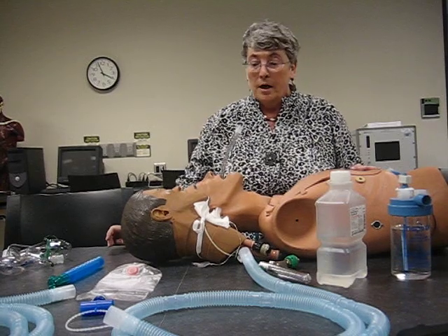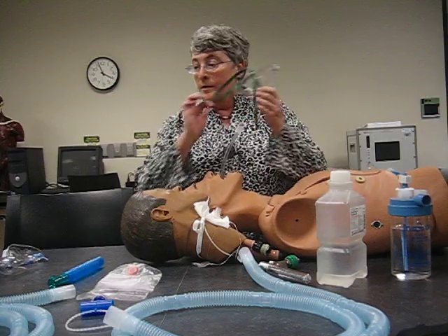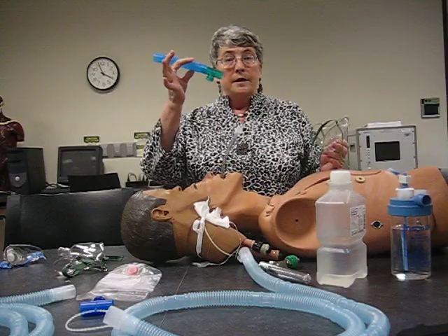Hi, I'm Kelly Busby with Kingwood College, and today we're going to set up a trach collar. We're also going to set up an aerosol mask, a face tent, and an ET tube T-piece.